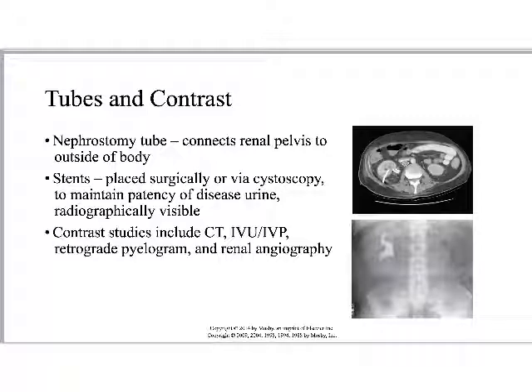But what they're doing as they place that cystoscope oftentimes is creating a stent. And that stent's going to be run up the ureter, again, to the renal pelvis. It will coil up in the renal pelvis and stay anchored there. And when you see it on x-ray, which you've probably seen, it's just going to look like a long line of plastic. And it looks like the thing's blocking it off, but in actuality it's doing the exact opposite. It's a long drinking straw that's keeping patency, allowing the ureter to remain open, right?